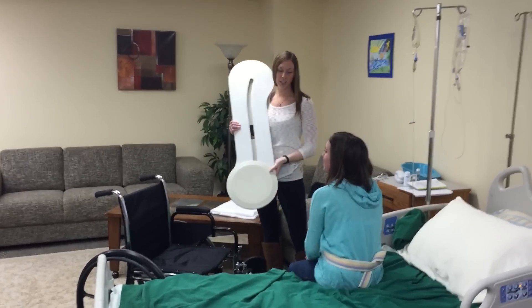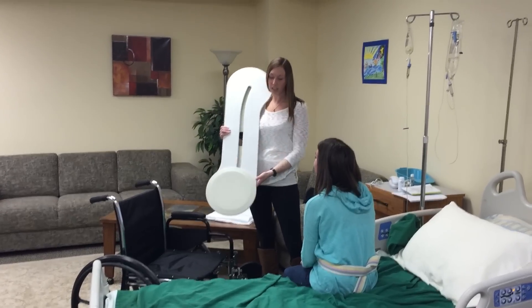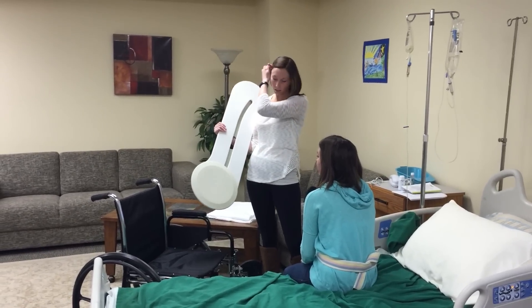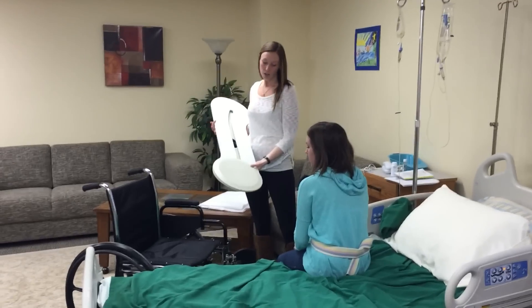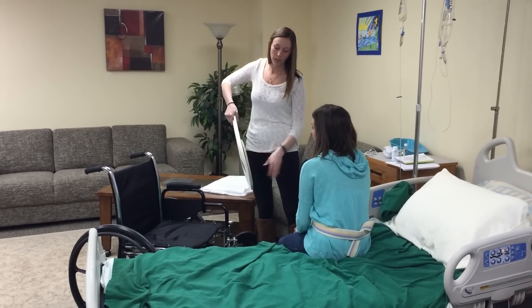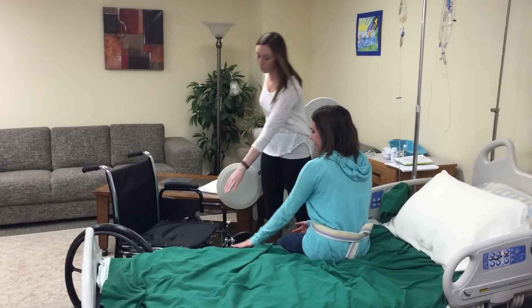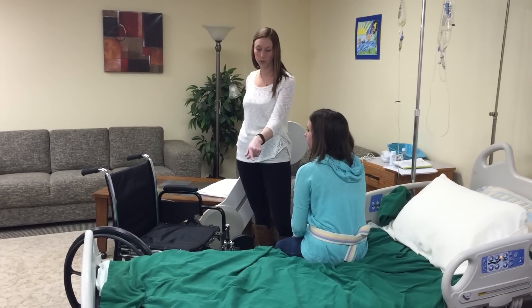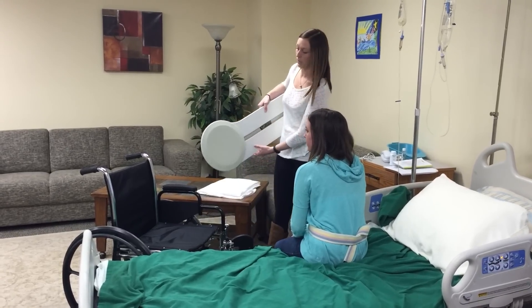Today I'm going to show you how to do a BC board transfer from a bed to a wheelchair. This is the original — there are two other boards as well that you can use for different transfers. You want to make sure that the height of the bed is the same height as the wheelchair. If it's more than 6 inches, you can take a towel or a sheet, fold it up, and put it underneath so it's level.